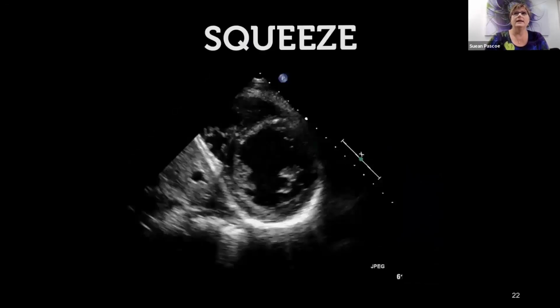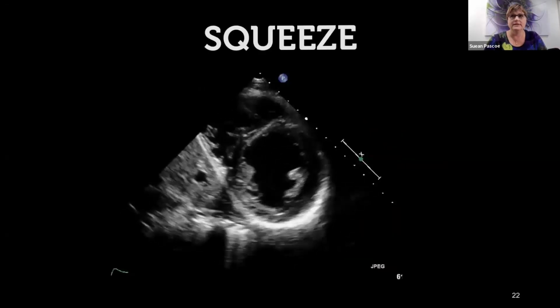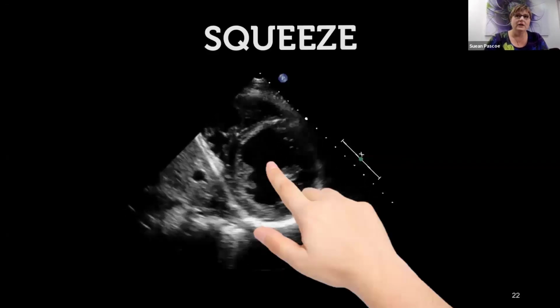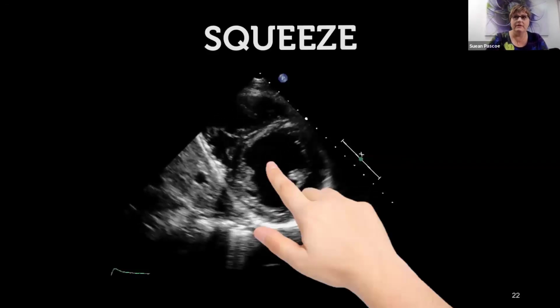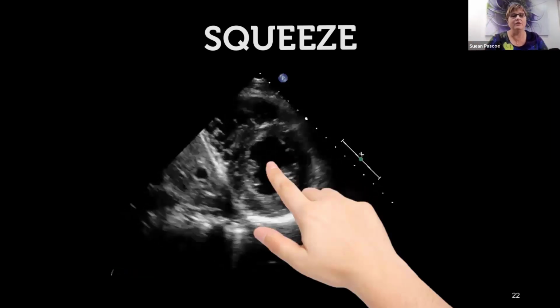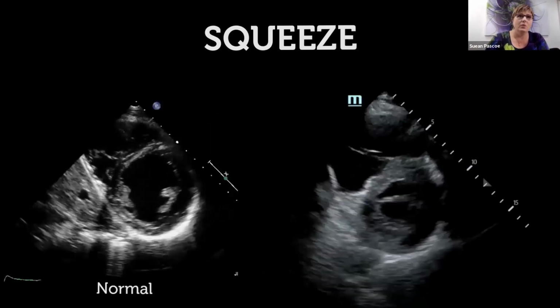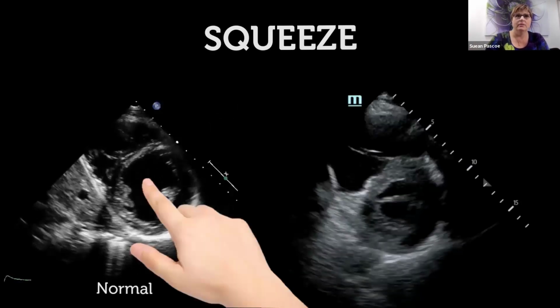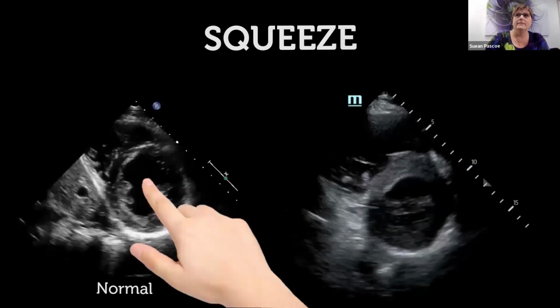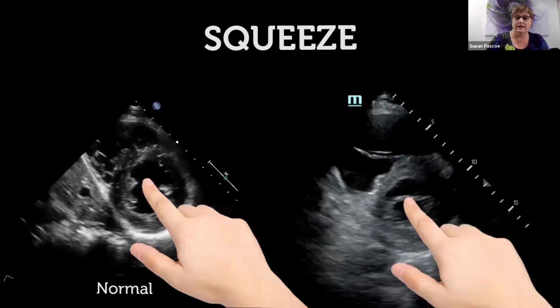The next thing we look at is how much squeeze there is. So in the normal heart, it should come in by 25 to 40%. Another way you can look at this is poke your finger. I know some of our team call this wet willy. Put your finger in the middle of the ventricle and make sure that the heart is squeezing and coming in evenly from all directions. And you want to see it come towards your finger in systole. Whereas when it's not pumping well, it doesn't squeeze as much, and you can see that it's not coming in as much as we're expecting here.